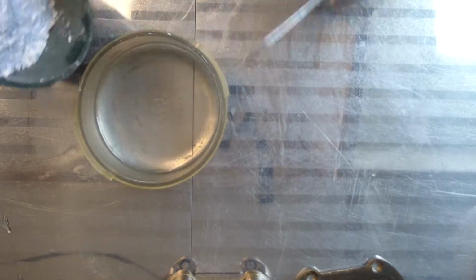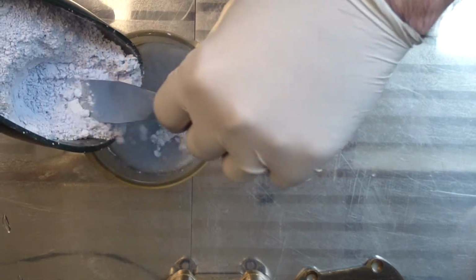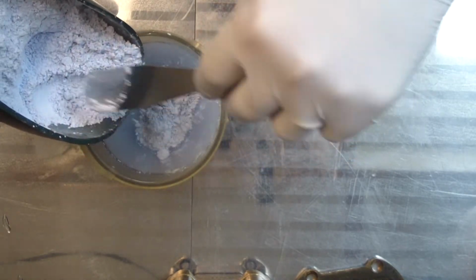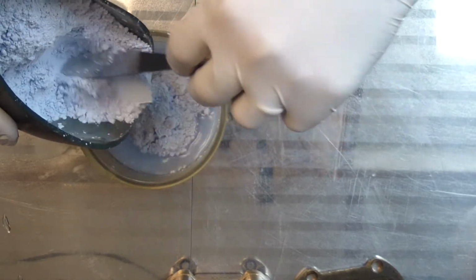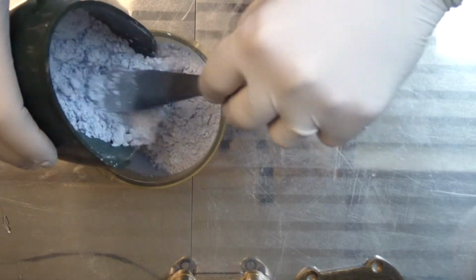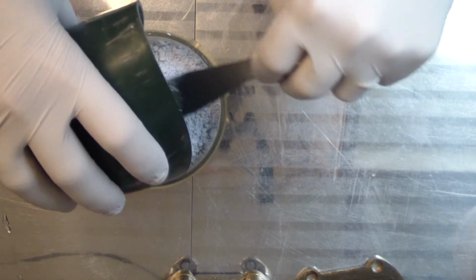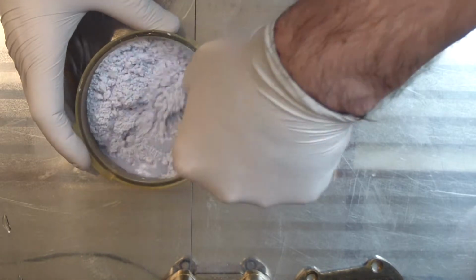And you always want to add your powder to your liquid. This way you get a much better mix and you trap a lot less air. And what I do is I'll add it slowly for a couple of reasons. I don't want to make a huge mess, to be one. And secondly, it will incorporate liquid into powder a lot more evenly, thus creating a more homogeneous mix and making things a little bit nicer for you. So you just kind of add everything into it and you just kind of slowly mix it in.